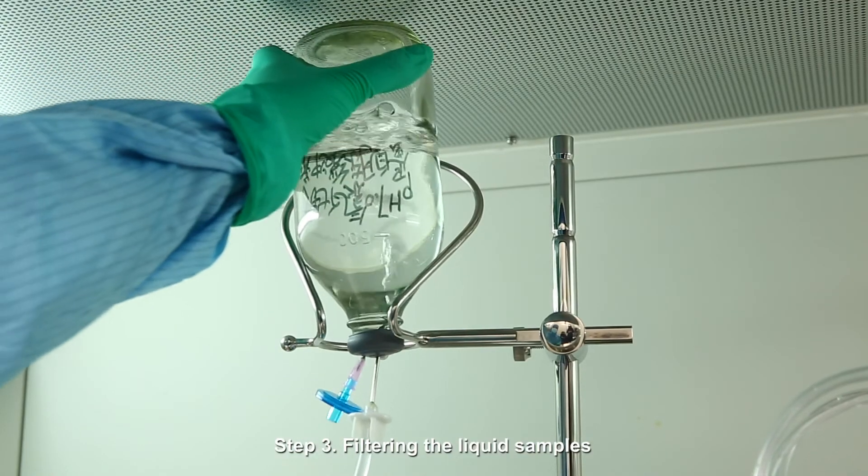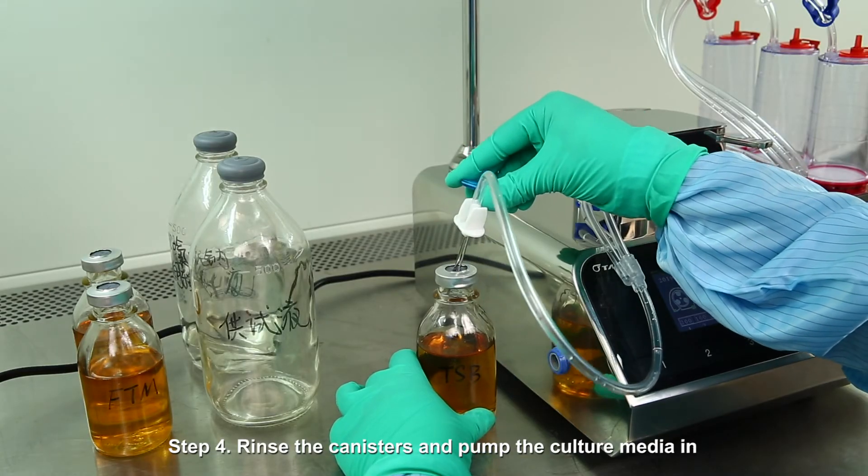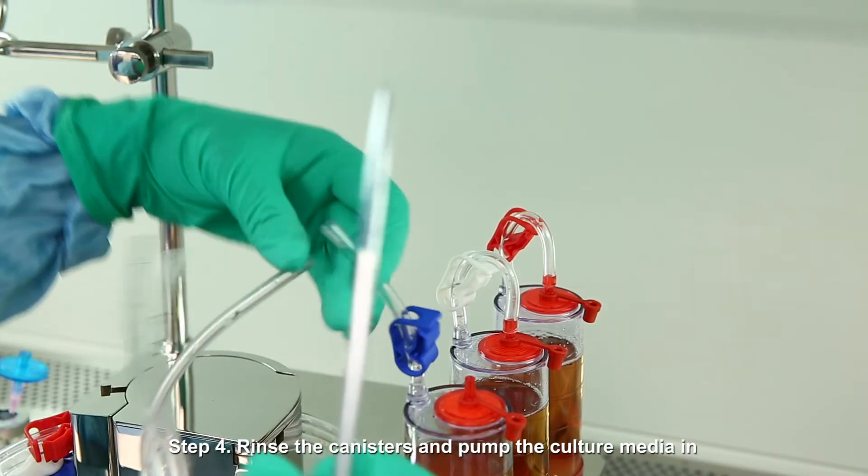Step 3: Filter the liquid samples. Step 4: Rinse the canisters and pump the culture media in.